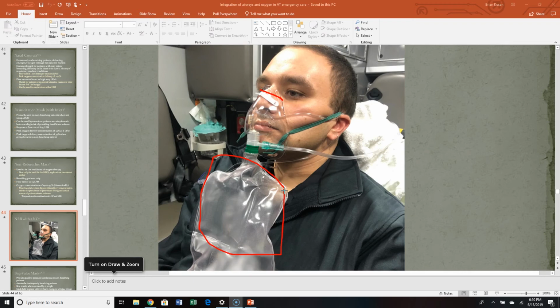So we can be starting at something like 12, but okay, that's not enough. I can go up to 15, and you can even theoretically go higher. But as mentioned earlier in the skill section, the faster we run the tank, the faster we deplete it. And D cylinders give us best case scenario of about 18 minutes at 12 to 15 liters, and we're going to go through that faster and faster.